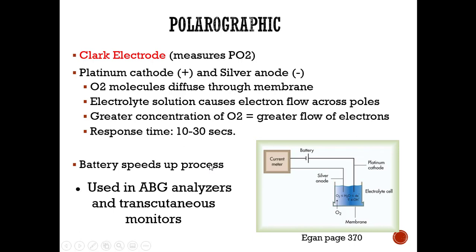There is a battery that will speed up the process that you kind of have to know, in the sense that later on we're going to talk about how to troubleshoot O2 analyzers that aren't working, which hopefully will come in handy for the O2 analyzers that are not working in our lab currently.